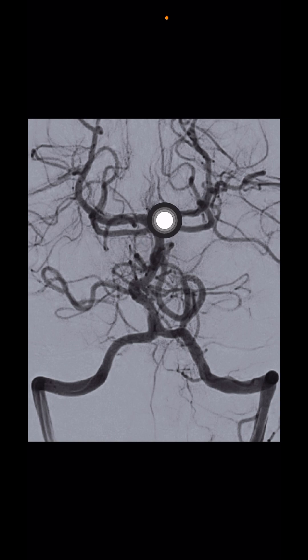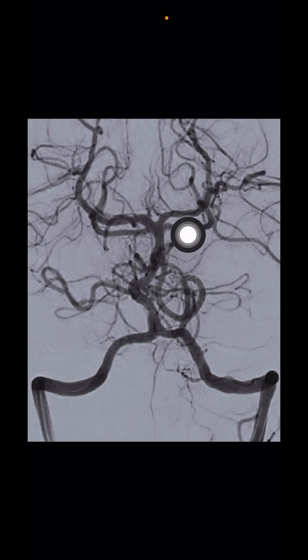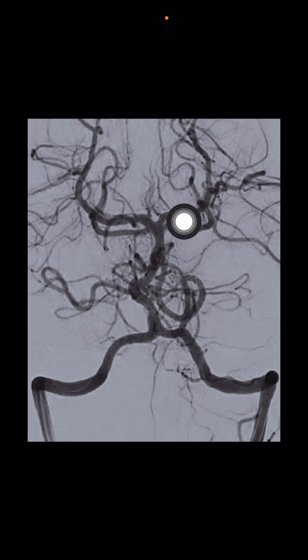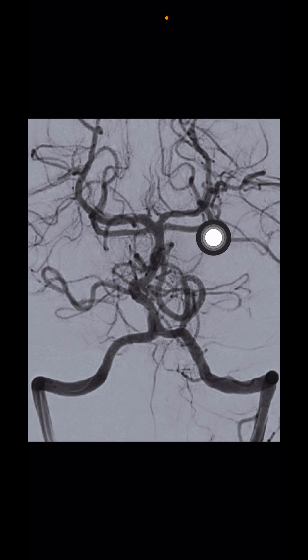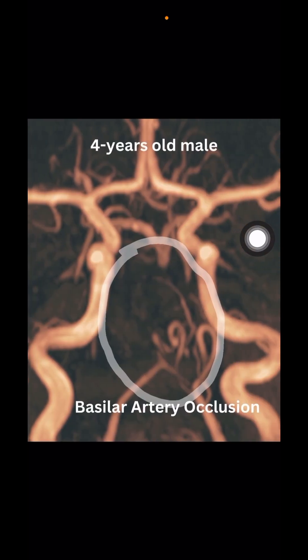Those terminal branches are the posterior cerebral artery, as you can see here. Just below the posterior cerebral artery you can find the superior cerebellar artery — and if you remember, in between them is the origin of the third cranial nerve. Here is a much clearer view with a 3D reconstruction of the same image.